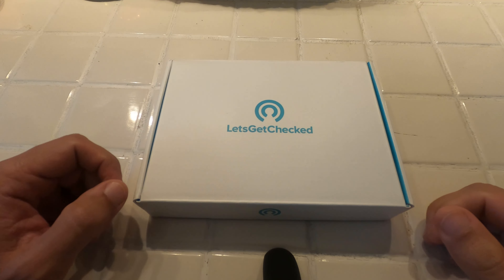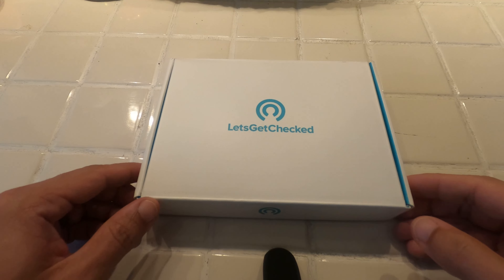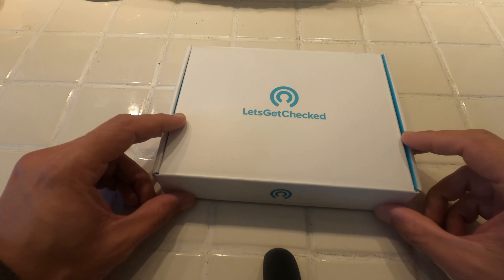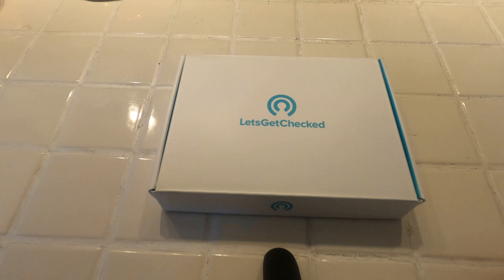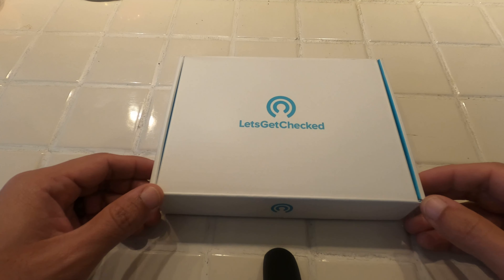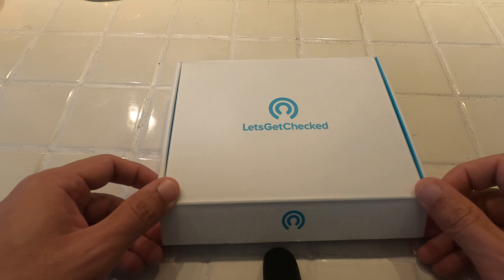So this is the male hormone Let's Get Checked test unboxing. It comes in this little box here — discreet packaging so nobody knows what you're getting. They have a whole host of tests on their website that they can send you, then you send it back. This is my first time actually opening the box and seeing what's inside.